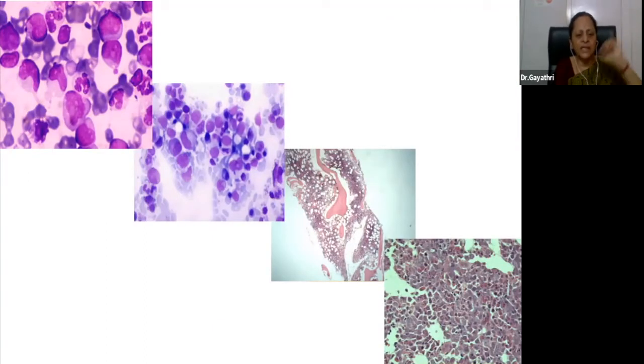Actually, one of the slides that you had seen earlier. Marrow aspiration was done because in a Fanconi anemia, one is not very surprised to see that it transforms to acute leukemia. Sure enough, we picked up numerous blasts here in the aspiration and in the biopsy imprints.